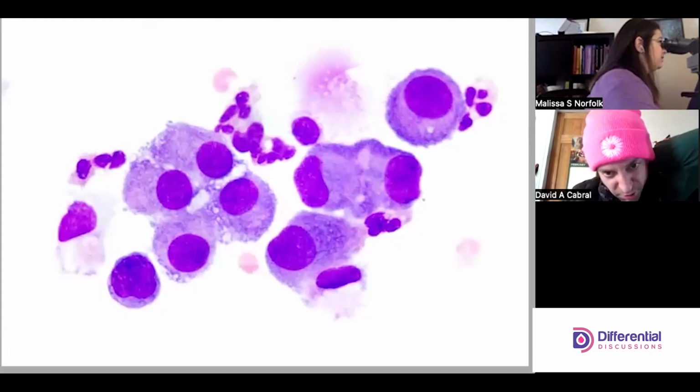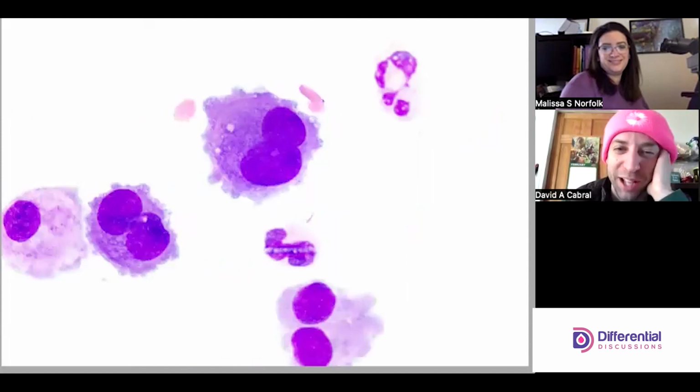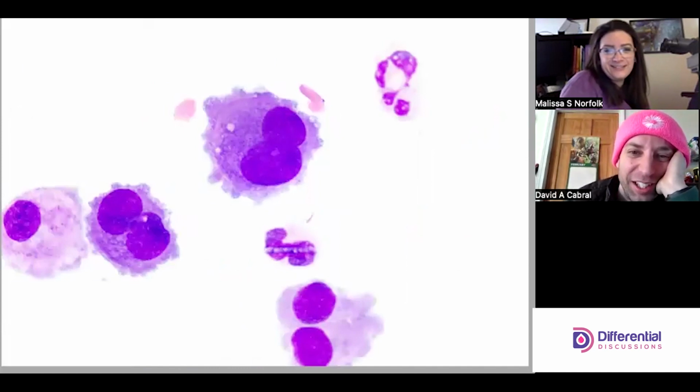See what else we can find. Great learning opportunity. Oh, look, there's a binucleate one. Yeah, there's another clue too. I haven't seen too many binucleated plasma cells, not normally. That's a fair point. And the other thing is it's just so perfect, like the nuclear contour.